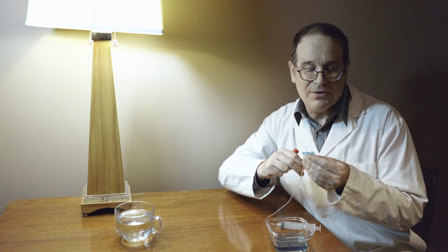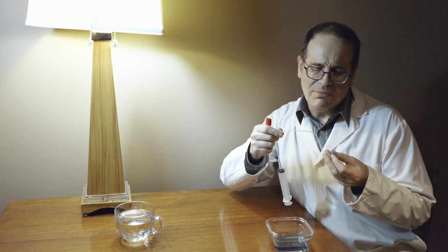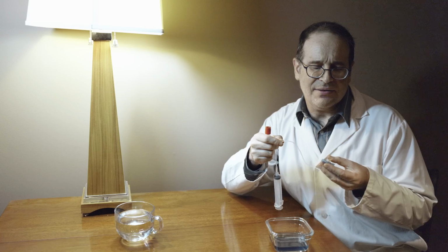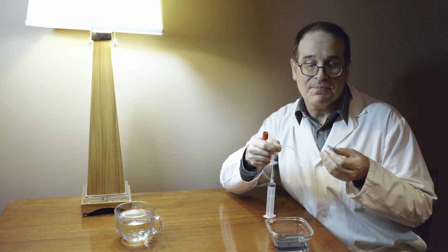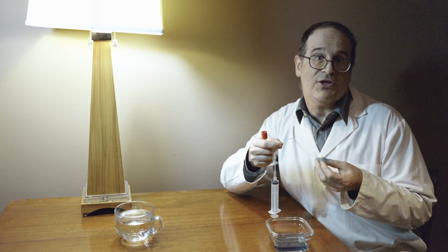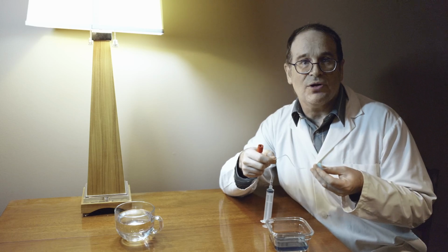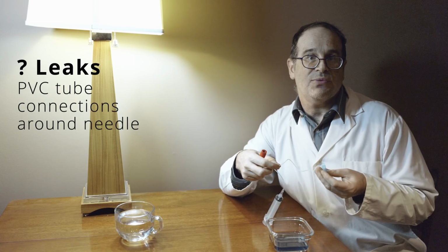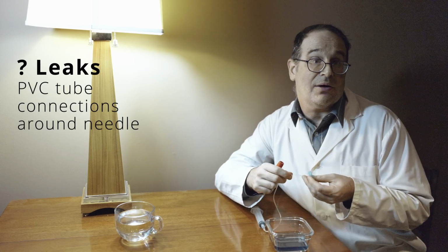So it becomes a simple matter of calculation. In the needle itself, blood is traveling at 25 kilometers per hour, and in the tubing, approximately 3 kilometers per hour, or about 800 millimeters per second. That's dramatically faster than most of the bubbles, and so the bubbles appear to be getting stuck on the tube wall itself. But I would go further and suggest the majority of the bubbles that we're seeing on subsequent draws are exactly the same bubbles that we saw before. Very few of those bubbles are detaching and entering into our tube.